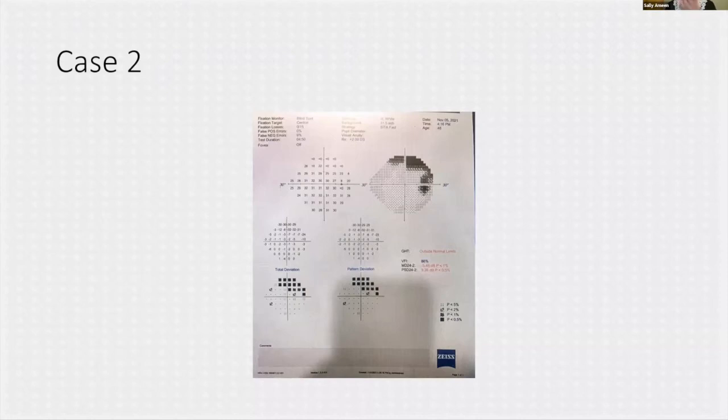So in the first instance, this is the visual field that we were presented with, and actually the parameters don't look terrible. Sorry, my lighting is not great, but all in all, it looks like a fairly reliable visual field. He does have some false negative at 9%, but no false positives. So obviously he's not trigger happy, and it's all focused superiorly.